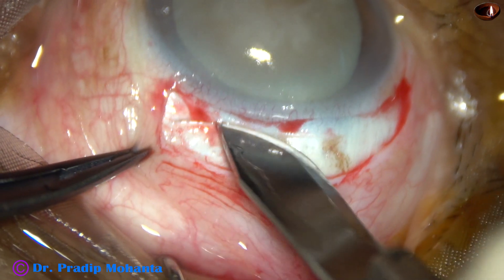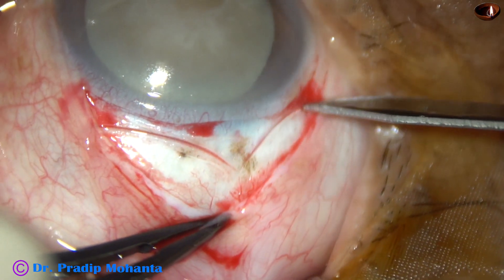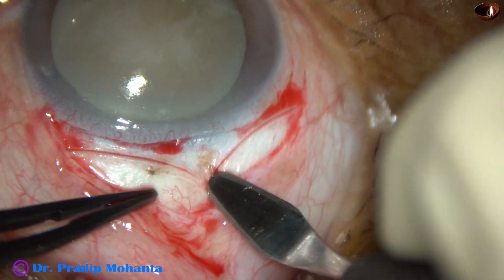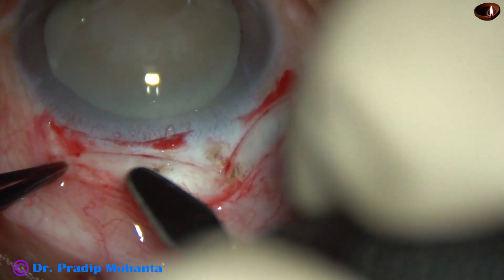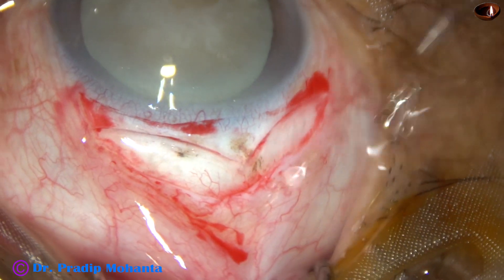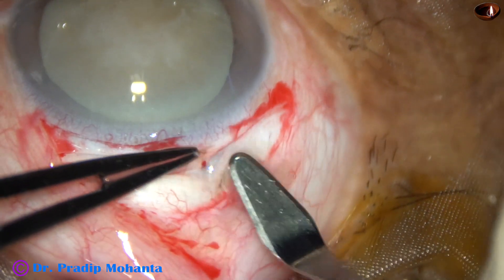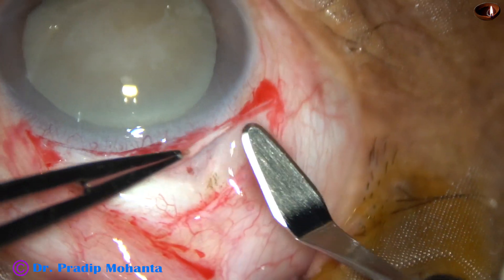This is the 1st SICS incision, and this is the adjoining 2nd SICS incision. Now we are going to make the tunnel just like we make it in SICS. Since 2 SICS wounds are adjacent to each other, we can call this DSICS — Double Small Incision Cataract Surgery, or LICS, Large Incision Cataract Surgery.